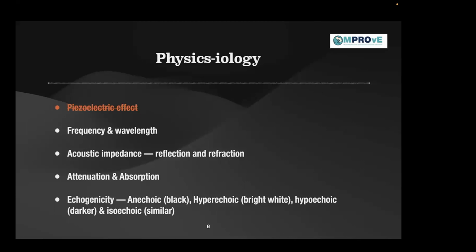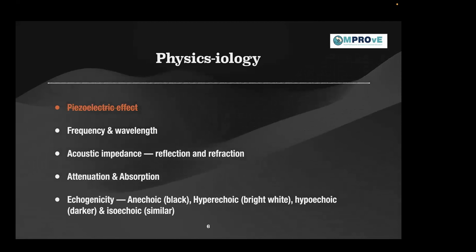Right, frequency and wavelength. Very crucial to understand here the concept of frequency and wavelength. Because when we know this, then we choose the right probe, not only for lung ultrasound, but for any point of care ultrasound, be it brain, abdomen, echoes, scans for the lines and stuff like that. So how you're going to choose your probe depends on this concept of frequency and wavelength of the ultrasound wave.